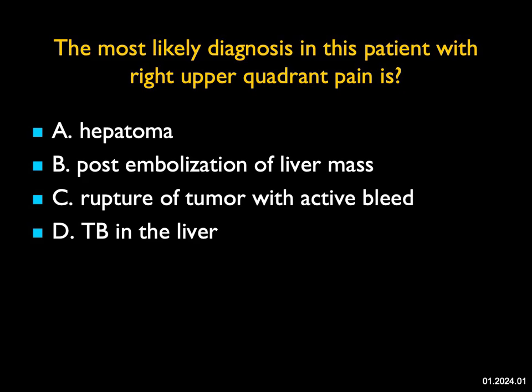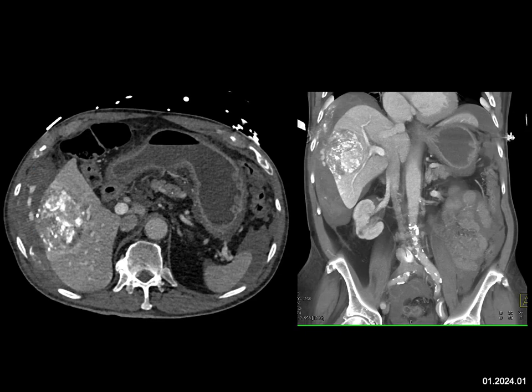In this patient with right upper quadrant pain, the most likely diagnosis is? If you look at the images carefully, you see there's a mass in the liver and there's high density. That's not calcification — this patient had chemoembolization, a TACE study, which is one of the ways of treating hepatoma. But if you look carefully, there's actually bleeding from the tumor — the tumor has ruptured, or the capsule has ruptured. We talk about bleeding in the liver with hepatic adenomas, hepatoma, and metastasis. One of the complications of TACE is rupture of the capsule of the liver with active bleeding, which you can see very nicely in this case.